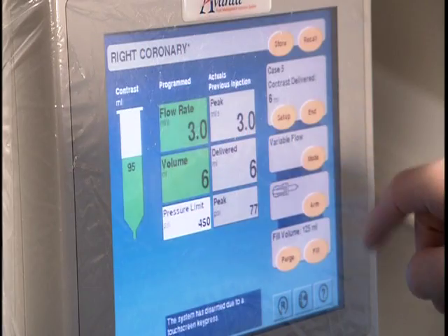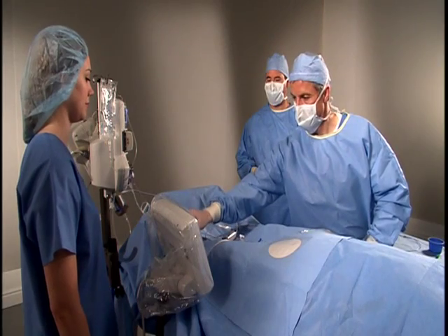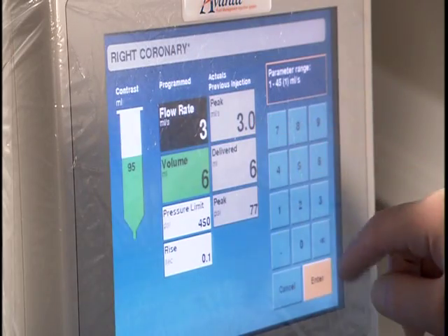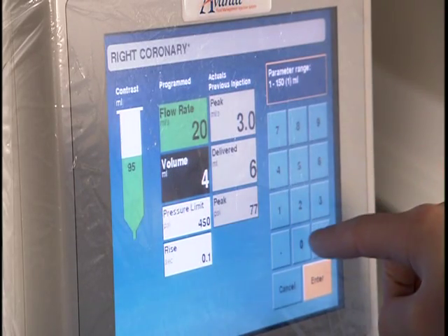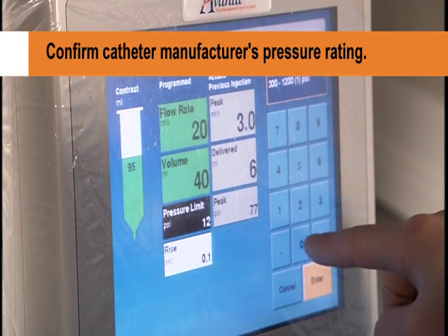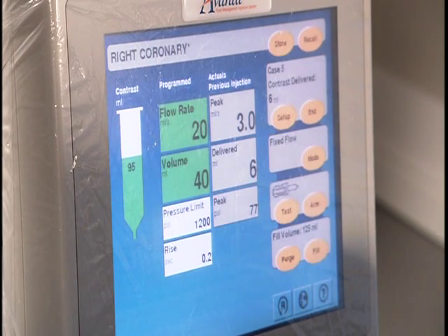Selecting Fixed Contrast Flow Mode enables contrast to be delivered at a fixed rate up to the set volume. To program a flow rate in the fixed mode, enter 1 to 45 milliliters per second in 1 milliliter increments. Next, program volume from 1 to 150 milliliters. Then program a pressure limit from 300 to 1200 psi based on the catheter rating. Finally, program a rate rise from 0.0 to 9.9 seconds to minimize catheter whip.